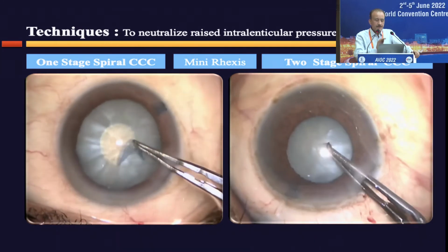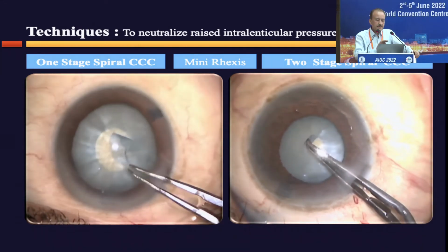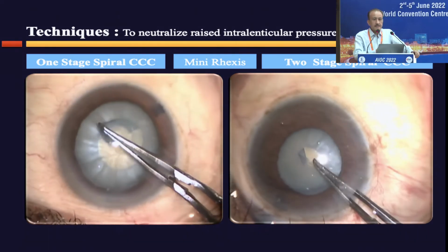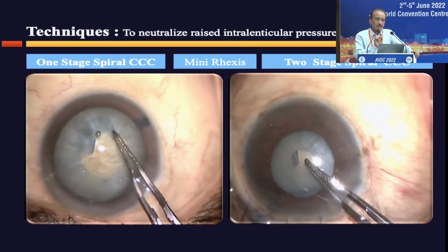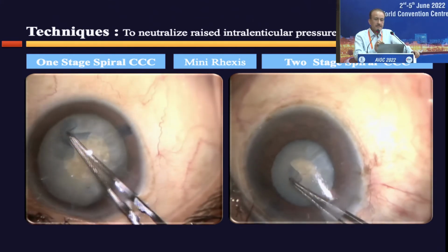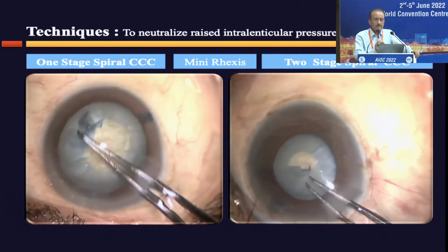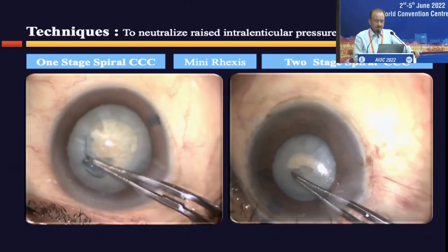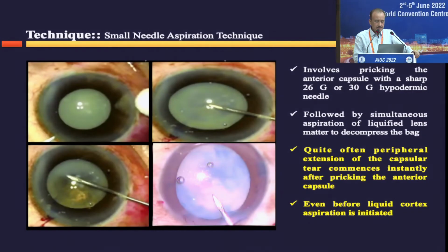And if the capsular intralenticular pressure is on the higher range of the extension, then these techniques would not work, because the moment you put a puncture on the anterior capsule, the moment you start tearing, the capsule would extend to the periphery even before you start the capsulorhexis. Including the small needle aspiration technique.